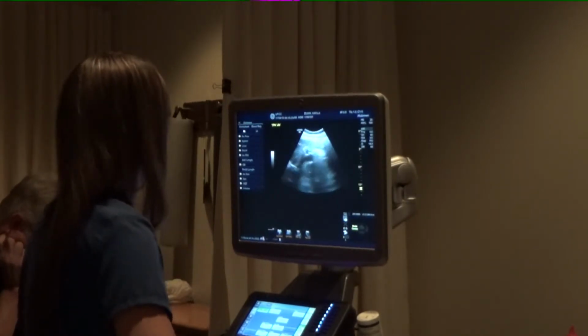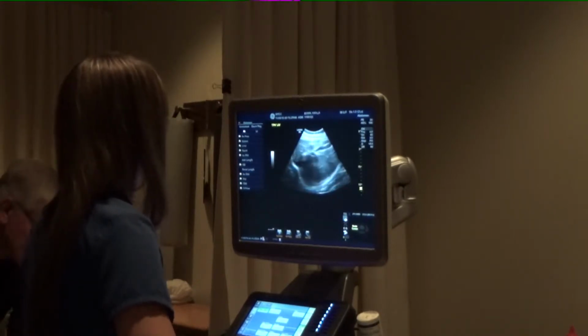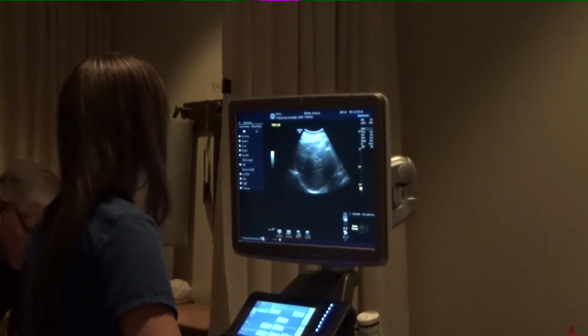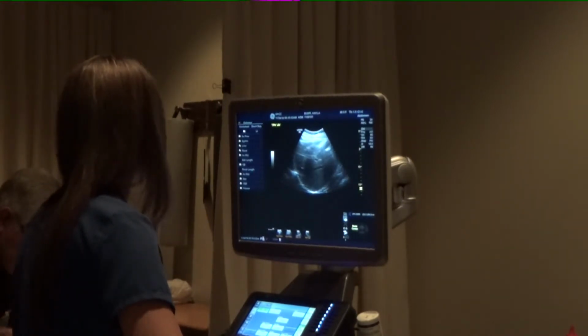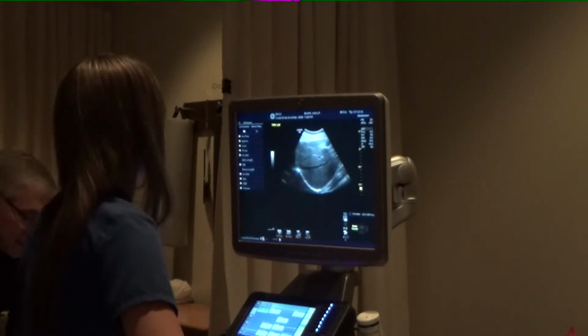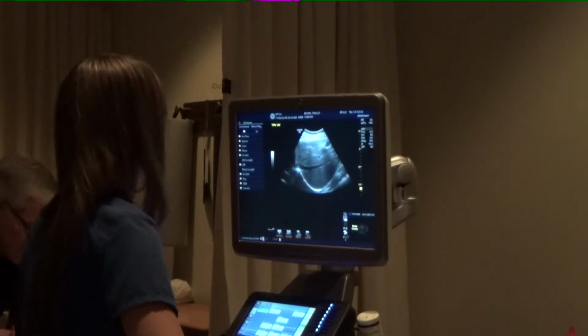Okay. All right. Beyond the echo texture and size of the liver, what other process is important to evaluate for in a patient with cirrhosis, and give 3 sonographic findings of this process? Sorry, can you repeat that? Beyond the echo texture and size of the liver, what other process is important to evaluate in cirrhosis, and give 3 sonographic findings of that process?